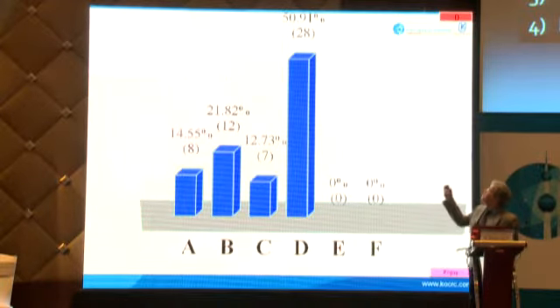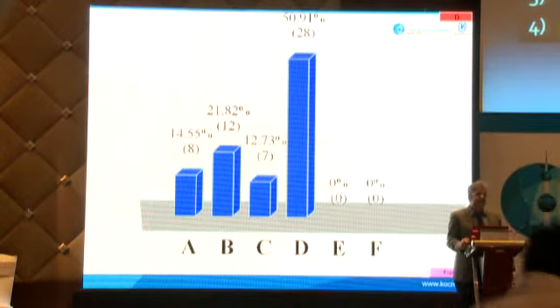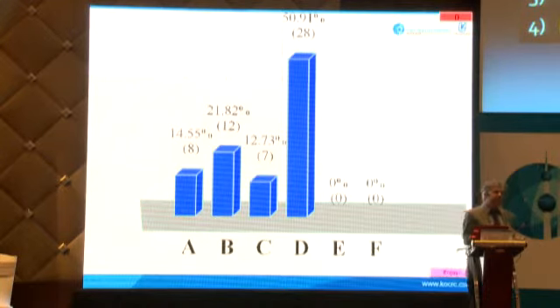All right. Well, fantastic. I don't need to show you cases because you're getting all the rare cases also. 50% of you got it correctly. And this was hypertrophic Olivary degeneration. Now this is an unusual disease which some people may not have seen, but it's a very specific one. And medulloblastoma is a common tumor which you'll follow up, and once in a while you'll see this, so it's important to remember.